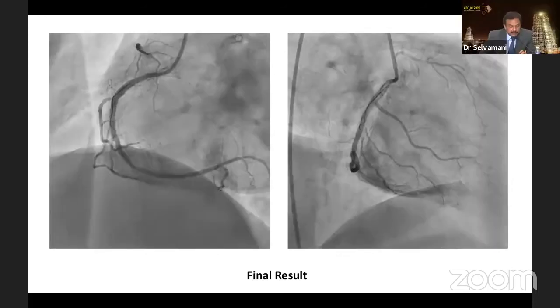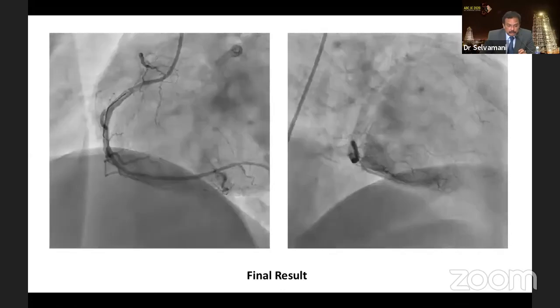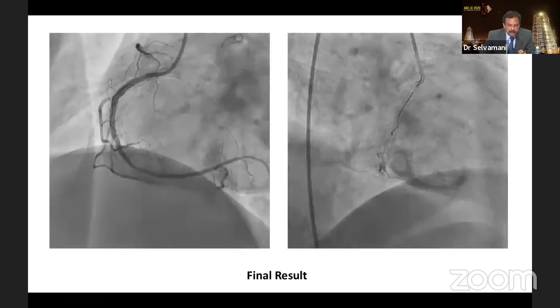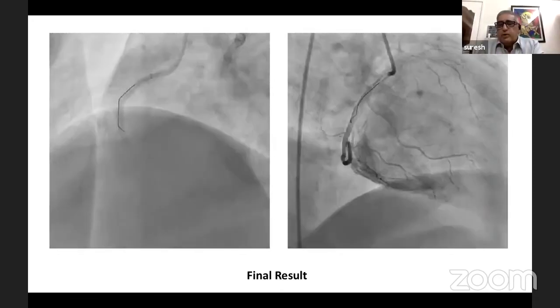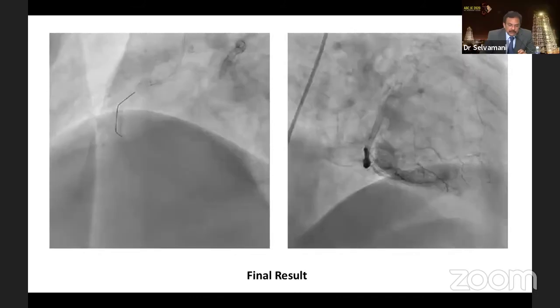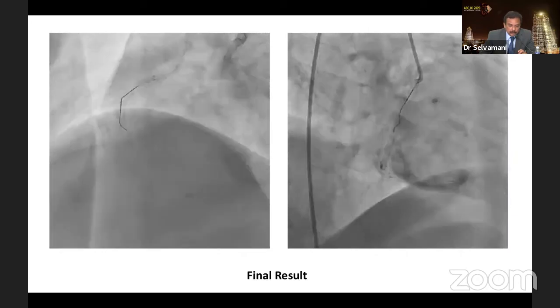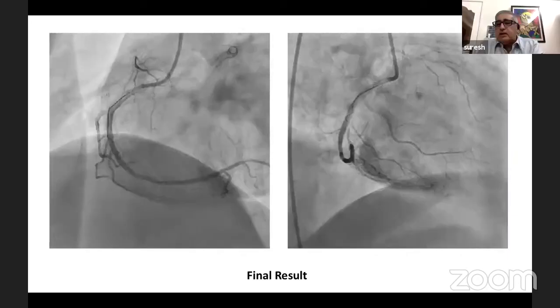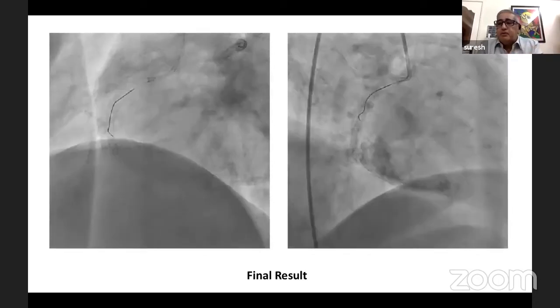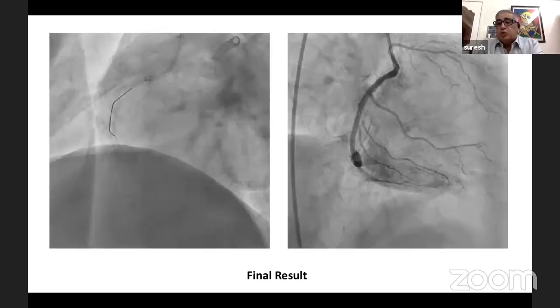Suresh, sir? Yes. Just to highlight, before taking a stent, do you do an OCT to make out how much preparation you have done? What is the lumen you have achieved? We do that, yeah. We would balloon it, do an OCT, see what's going on, then take a stent. Okay, then in that case, if you are still left with some tissue, if you can go with a bigger cutting balloon, your sandwich will be lesser. That's what we did to the right side. We went with the bigger cutting balloon. In fact, we went with the bigger cutting balloon even before we did a shot, because we realized we were going to have the same kind of problem in a much older stent anyway.